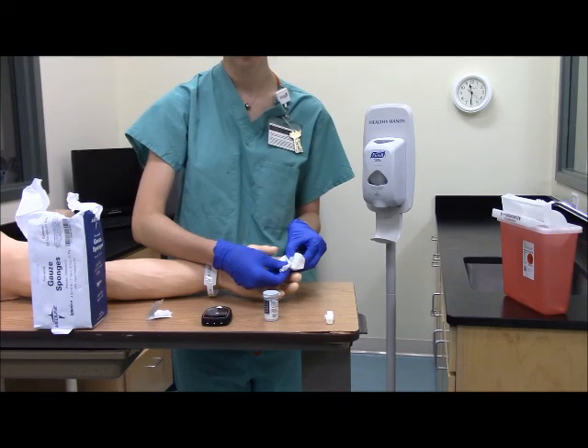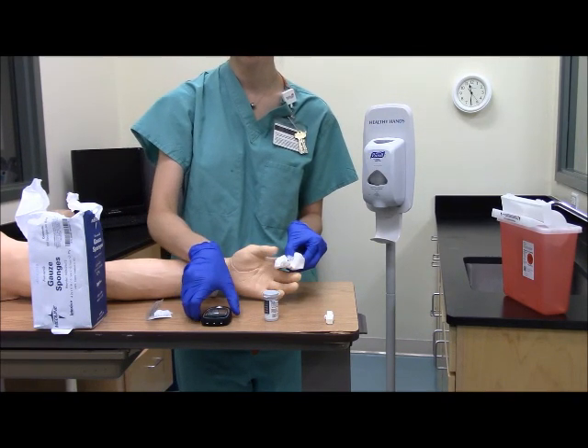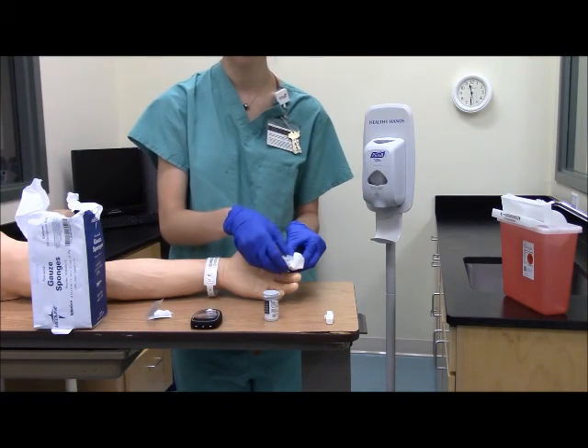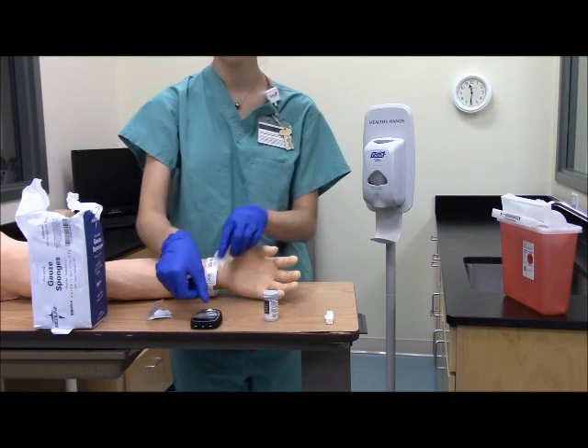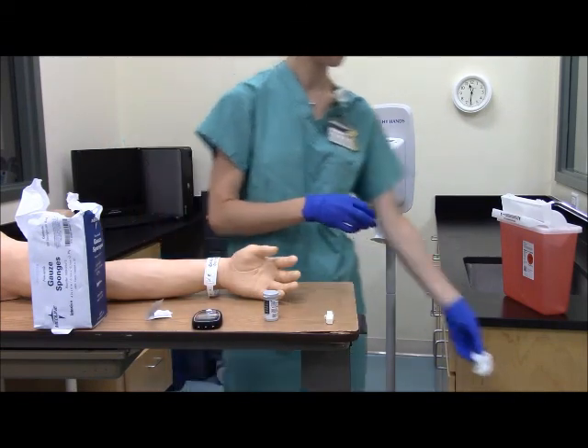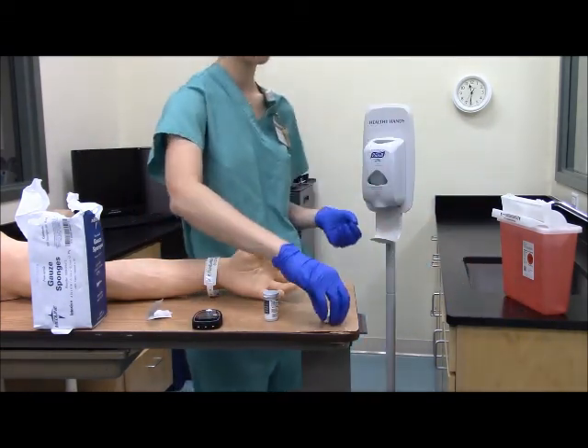Now you're ready to read the blood glucose results and document it appropriately. You can turn off your meter, remove the test strip, and dispose of the supplies appropriately. Place the lancet in the sharps container.